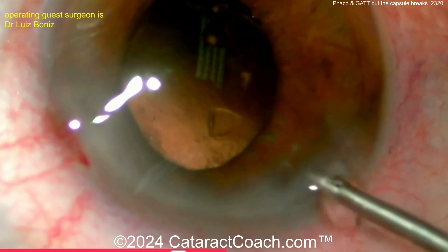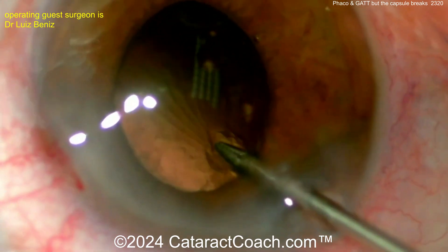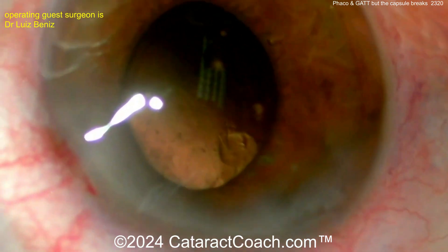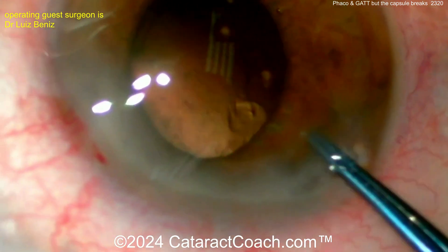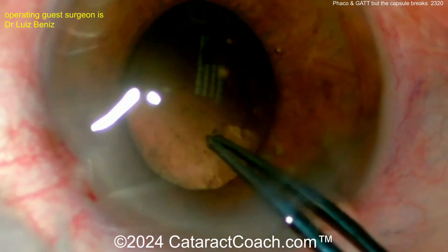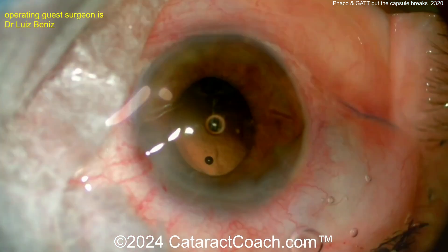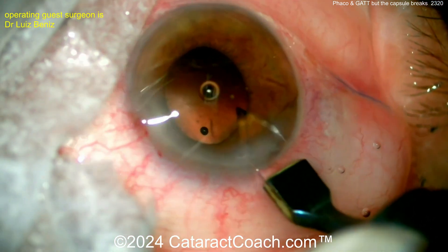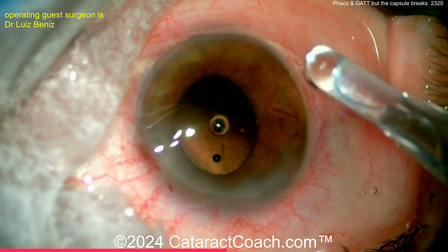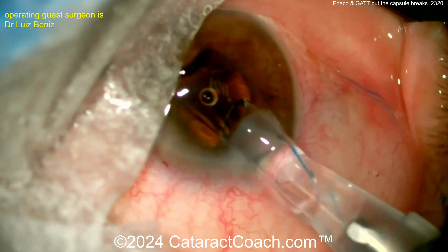The rent is small. Can you convert this into a little baby posterior rhexis? Grab it with forceps — but it's not easy. In a time of need with a posterior capsule break, sometimes getting a posterior capsulorrhexis is not as easy as you think. The surgeon is trying but not sure if we're going to get success here. So what do you do? Let's leave it. Enlarge the incision and get a lens in. A three-piece lens can be placed in the bag, in the sulcus, or optic-captured — wherever you want.